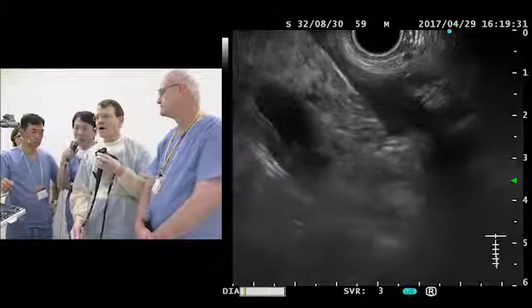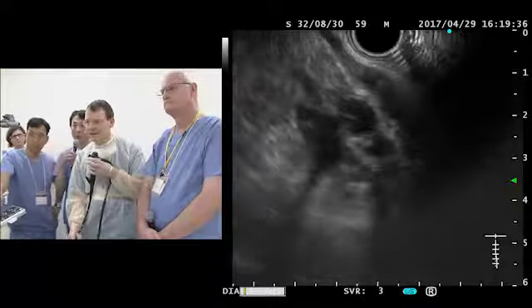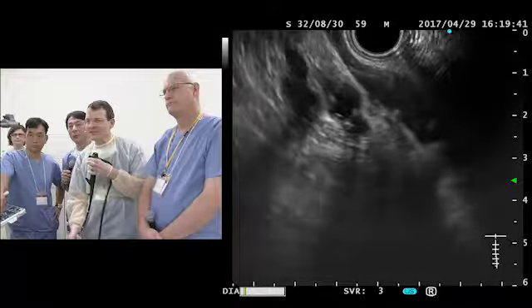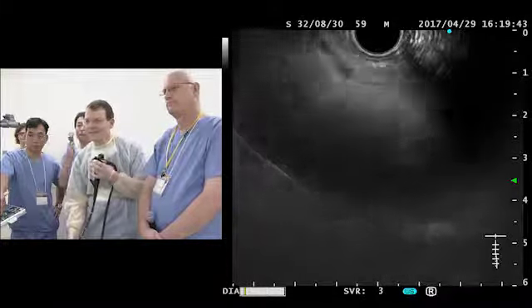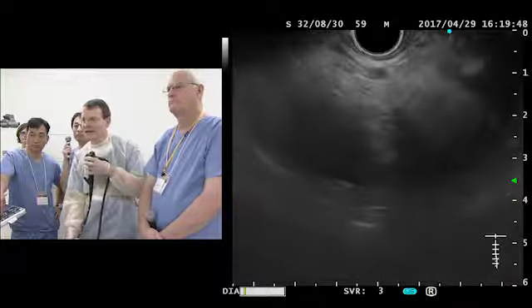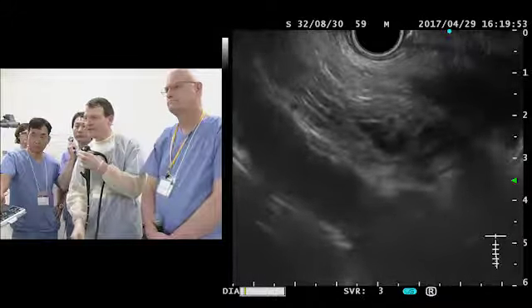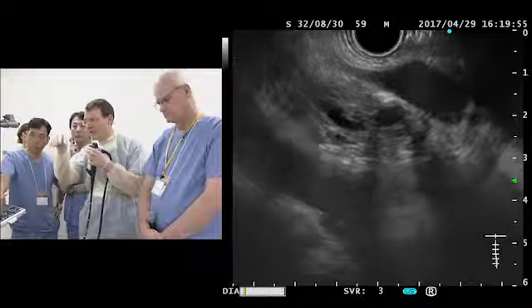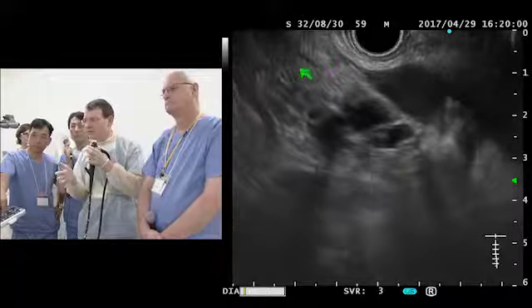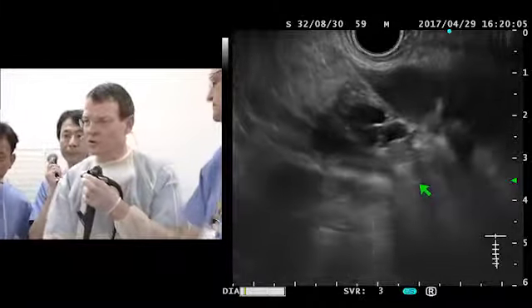Stefan, I cannot confirm the nodule. Can you confirm where is the nodule? Okay. So I thought, a moment, the point is, I think we will later anyway have to. The point is now the lesion we can see here very nicely because the pancreatic head we can see nicely from this area, but I think better later if we go to the duodenum and find the lesion again, because then it's more close.